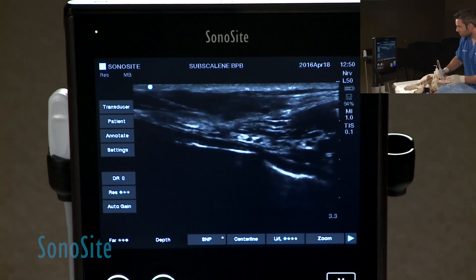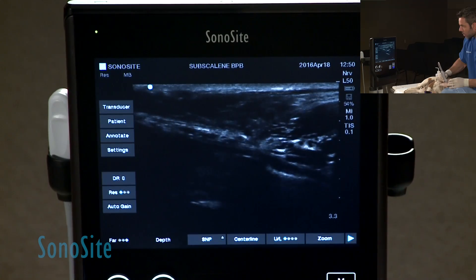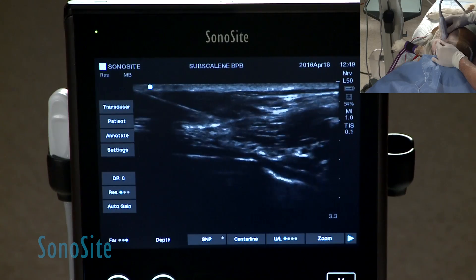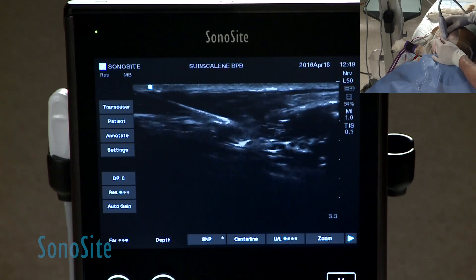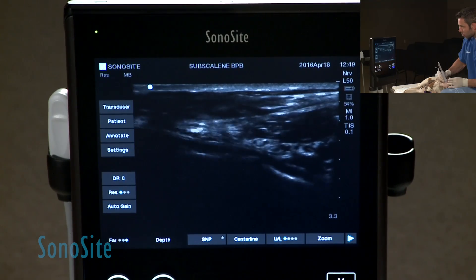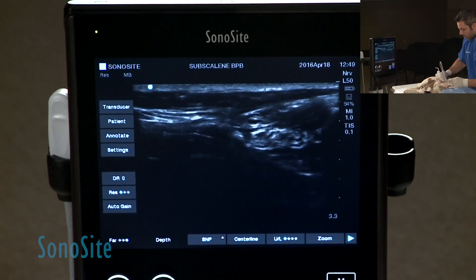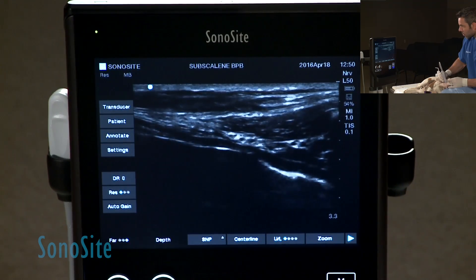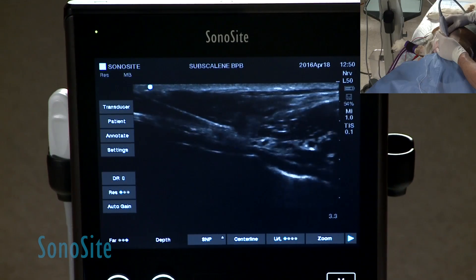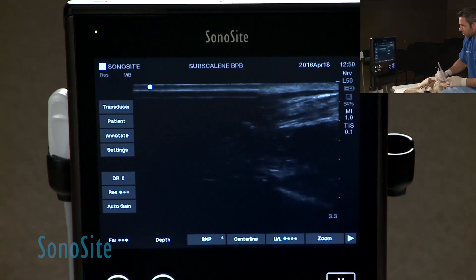You can see the needle coming out in proximity to the cranial portion. A lot of times I will turn off my stimulator once I get to this point so I don't get so much interference when doing this blockade. I'm moving again cranially to get the nerves. Because it's a very superficial blockade, the needle is just in the subcutaneous tissue almost — not much muscle — so it's trickier sometimes to get that distant image of your needle on the complete block. Once I see the contractions and find the whole plexus, I am then ready to inject with local anesthetic, starting from the most caudal portion of the plexus to the cranial portion.